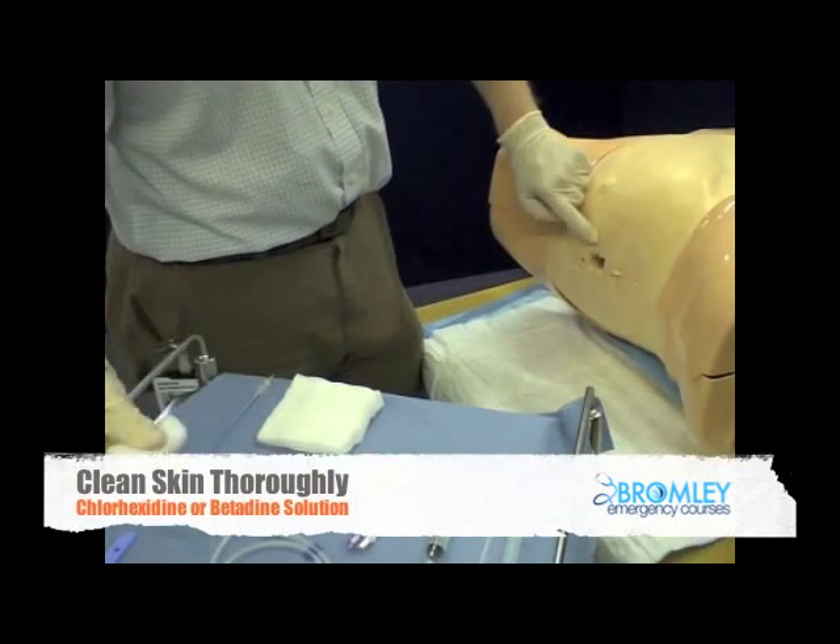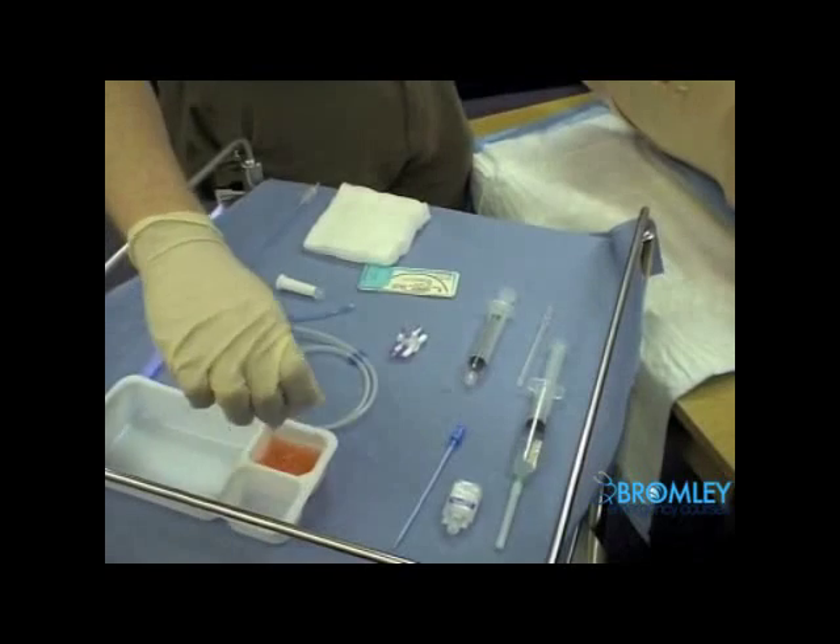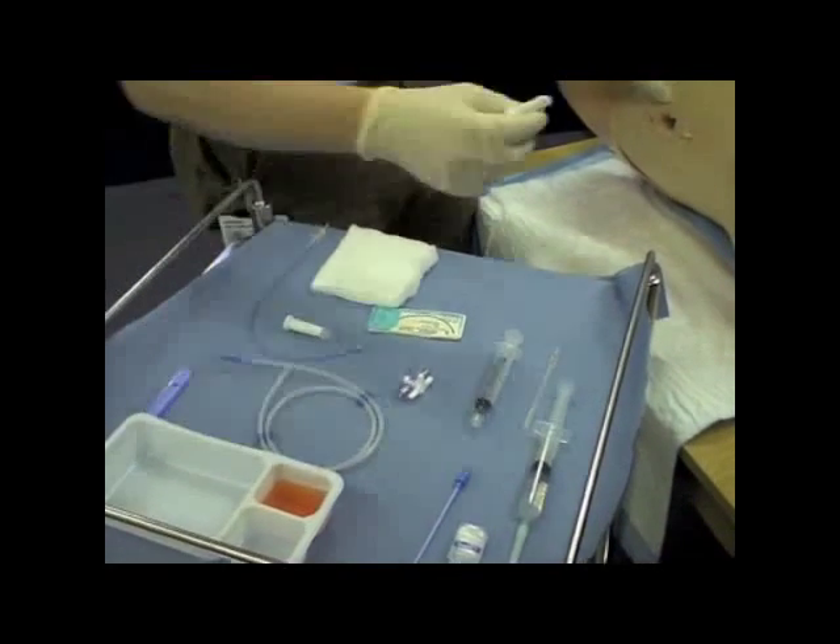I'm going to clean the skin with some suitable antiseptic solution — chlorhexidine and alcohol mixture.